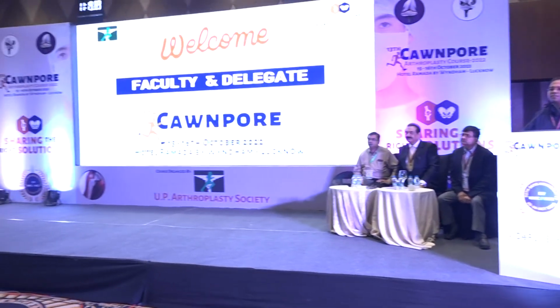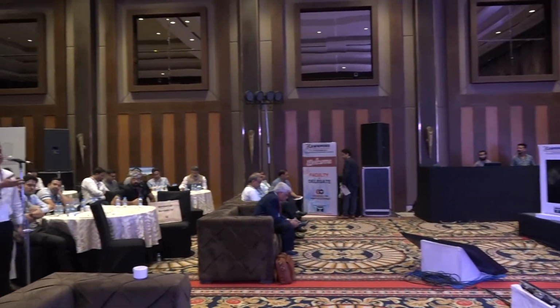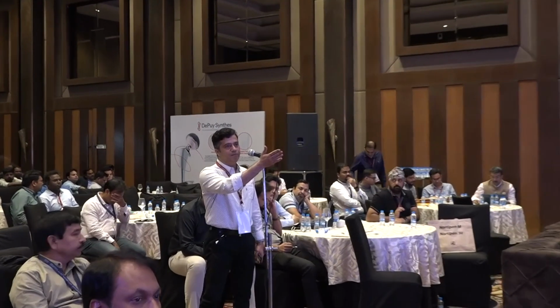Sir, Dr. Ravi, sir. As you rightly said, sir, this is Vancouver type 3B, so allograft bone strut is the option. I can see in one of your pictures that the proximal femur is going into slight varus. Because of that, bone loss is there, I think. I found this varus in the post-operative X-rays. Slight varus is there. It's visible. Can you put it on, man? Can you show it?